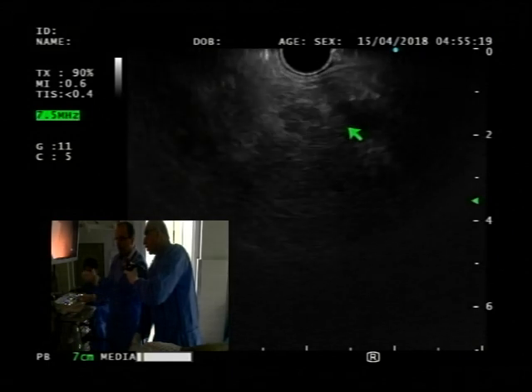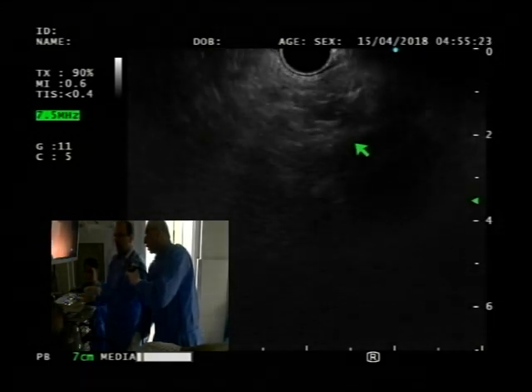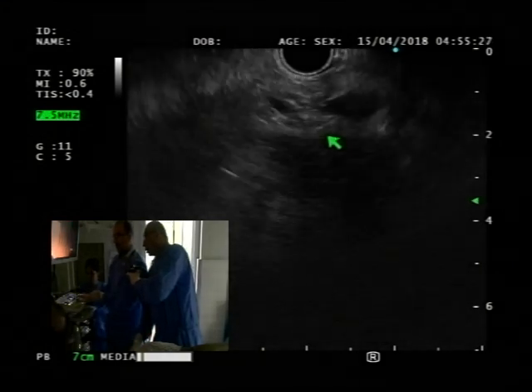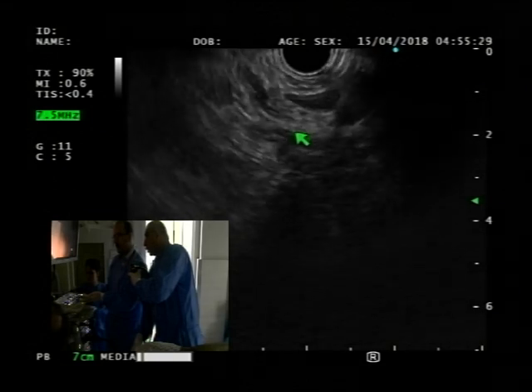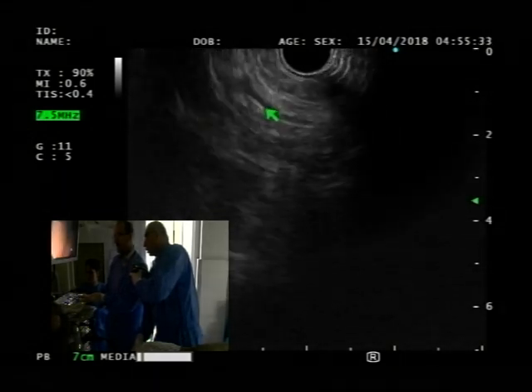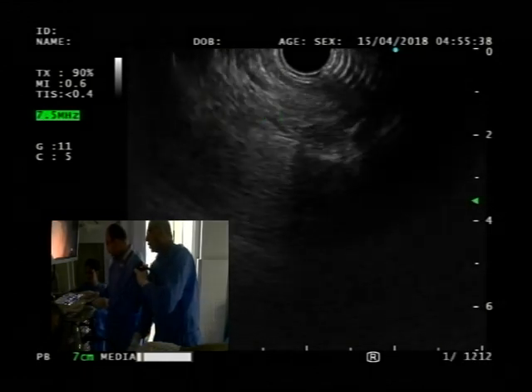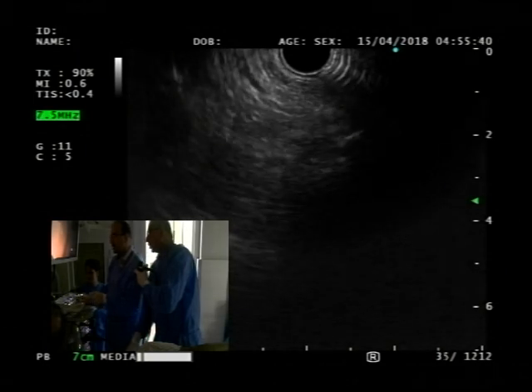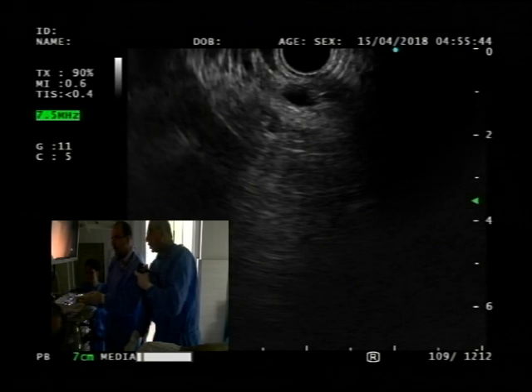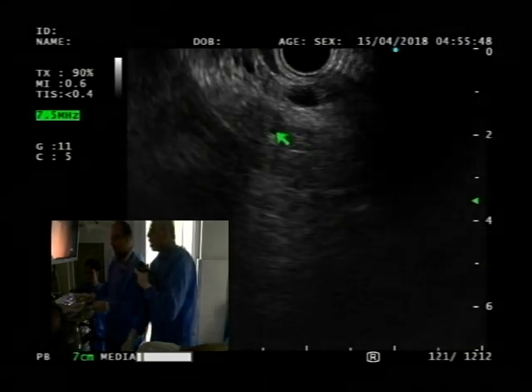So keep pulling back to keep it in view. There you go. Keep pulling back as you follow it. That's it. Excellent. You're following the pancreatic duct all the way to the tail. And what's interesting is below you, let me just freeze this, because your eyes were focused on that, but you also encountered the left adrenal. So this is your left adrenal gland.